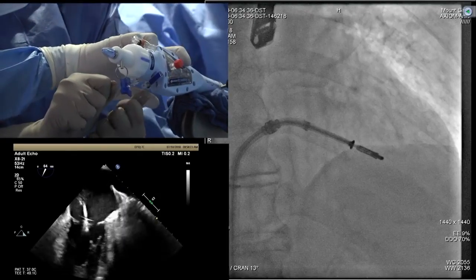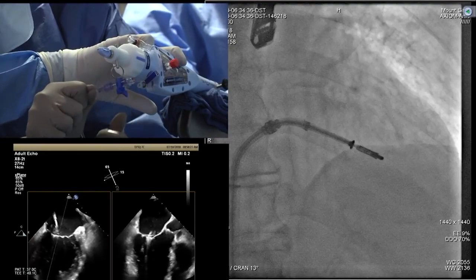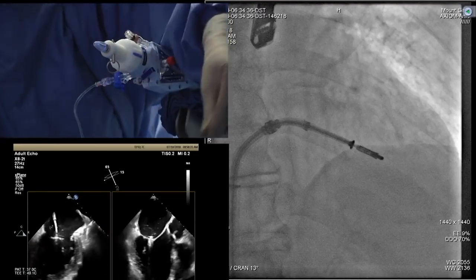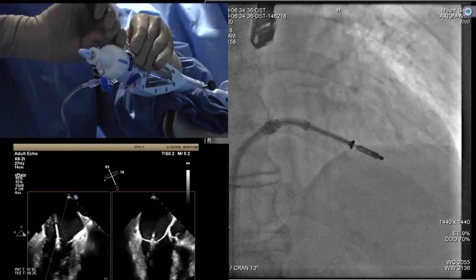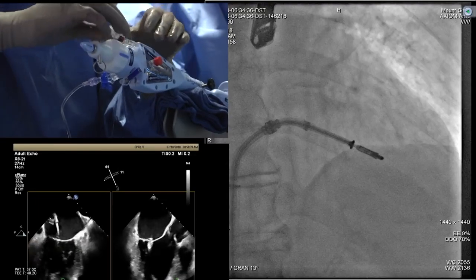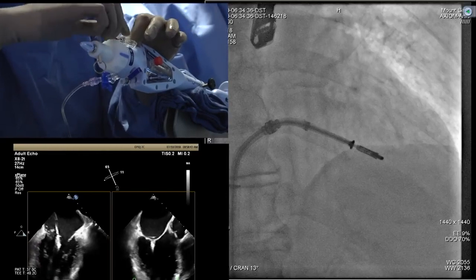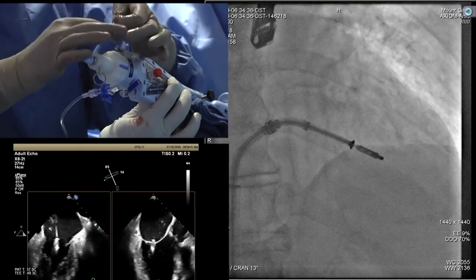Yes. They are a little tight many times, but what you can do is move a little bit. See there? Good. It's coming out. Now next is your clip. Clip line. Take this out. Same plastic. Then this is a white thread. So this one you can release it out.